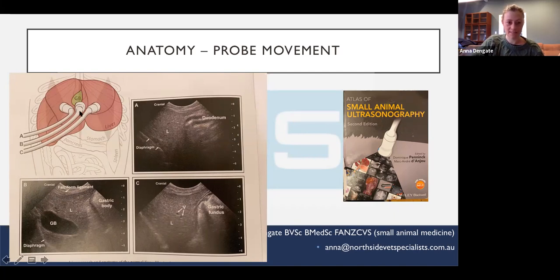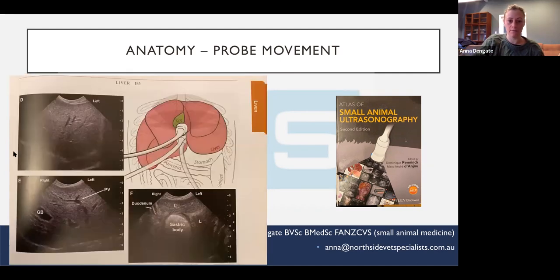And then I fan back to centre, check the gallbladder, and then I fan right out to the right to check the right side of the liver, and again keeping the diaphragm in the whole time. If you get the diaphragm in your view the whole time, you've only assessed the cranial-most aspect of the liver. So if there's liver that I haven't assessed, then I will move my probe caudally. So I will tilt rather than slide the probe, and then I'll do the same movement. So I'll go right to left further caudally, keeping the caudal-most aspects of the liver lobe tips in my view.